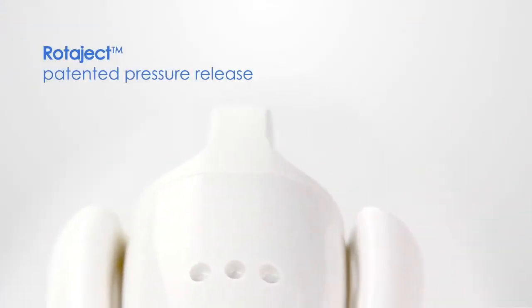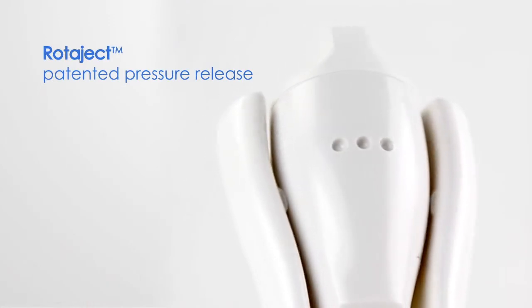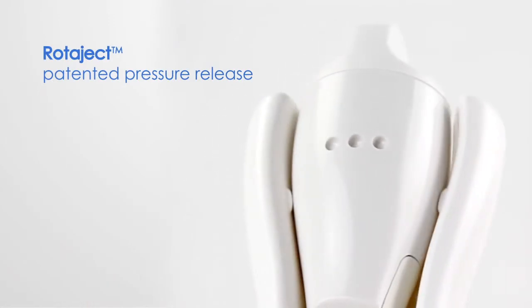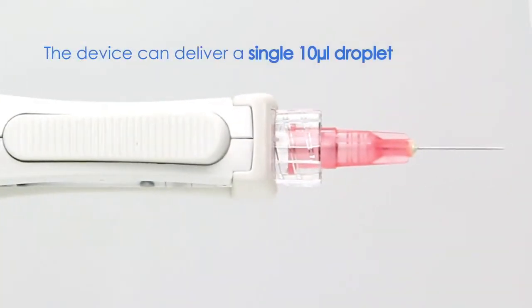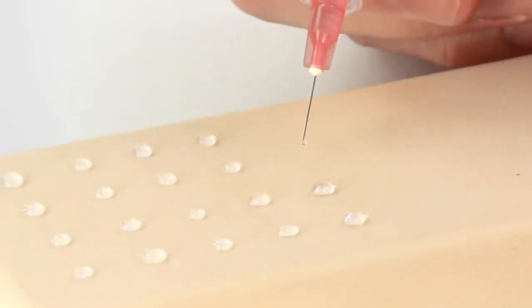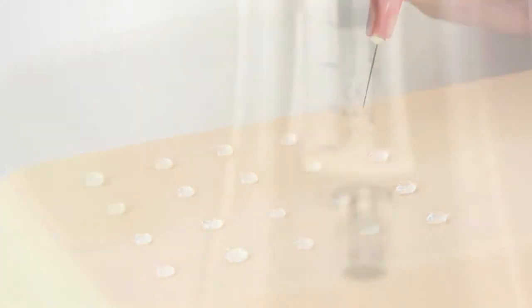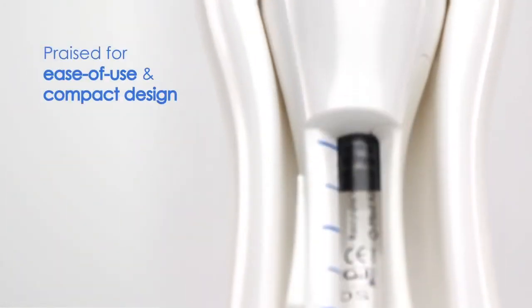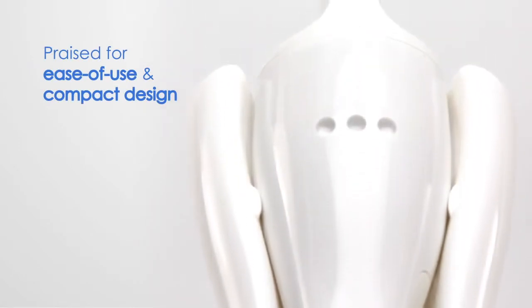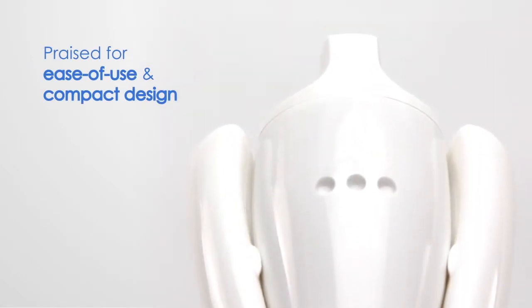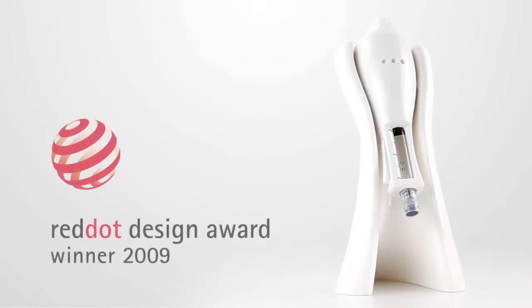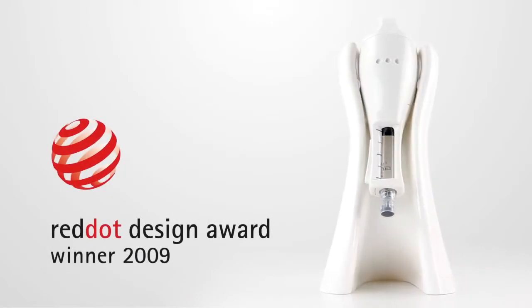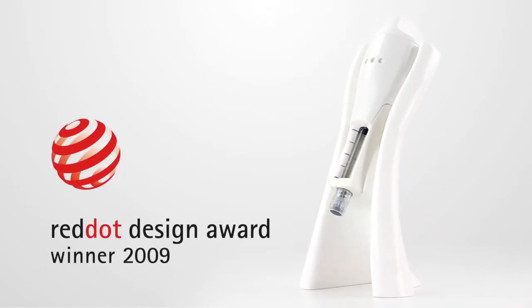Using a patented pressure release mechanism called Rotaject, the device can deliver a single 10µL droplet into the injection site with extremely small displacement variations. The PPI has received praise from doctors and clinicians for its ease of use and compact design and was awarded the prestigious Red Dot Product Design Award in 2009.